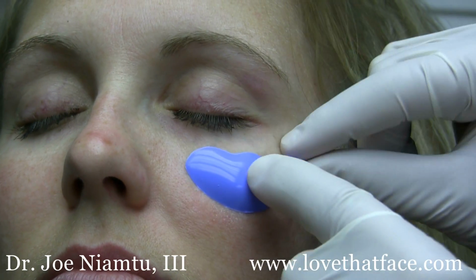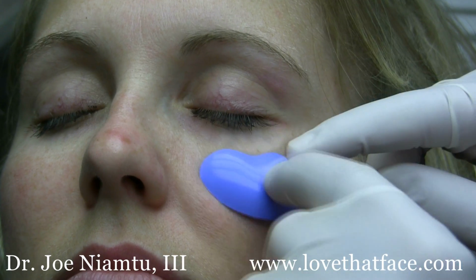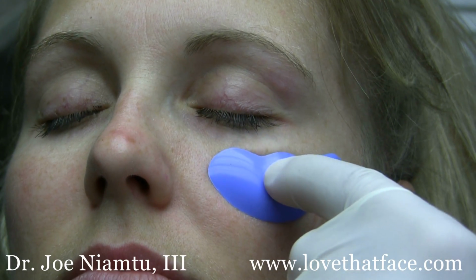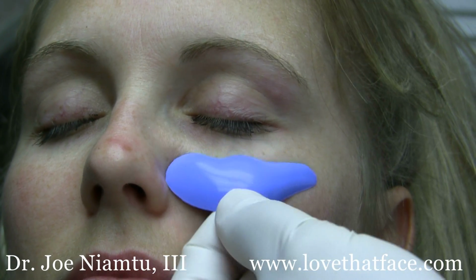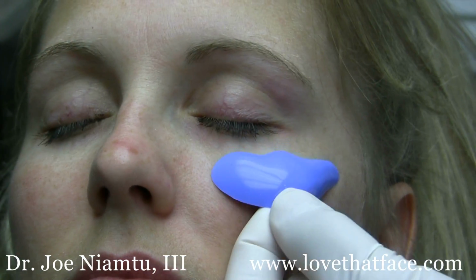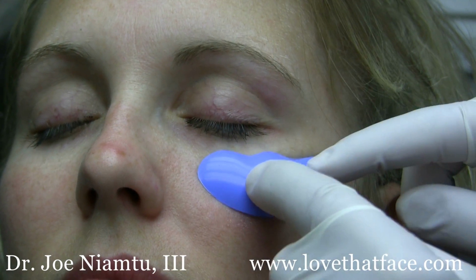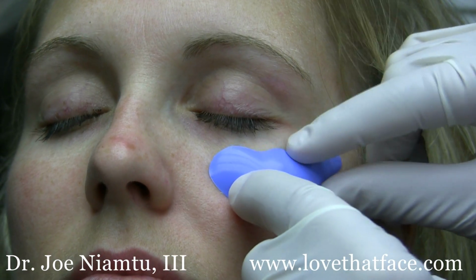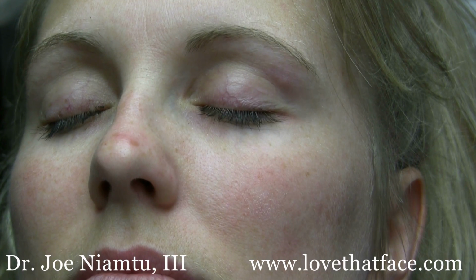So just to show you a difference, this is a small and this is an extra large, okay, which would be a pretty big implant. So you can see the difference in size. So it is the shape of the implant and where you place the implant that makes a difference. 99% of the time I'm using this implant, and 99% of the time I'm placing it right about there. And what does that do? That gives me the nice cheek apple right here, tapers off there, and the tail tapers off over the zygomatic arch. So that's what we're trying to do.